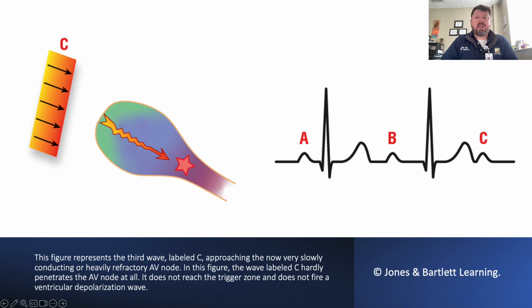This process of delay leading to further delay continues until eventually the refractoriness and delay in this AV node reaches a point at which conduction completely fails. This will be represented on the ECG strip as a P wave with a dropped QRS complex. The time supplied by the blocked impulse allows the AV node to reset, and so the next P wave will begin the whole process over again.